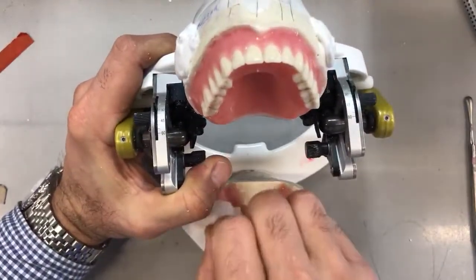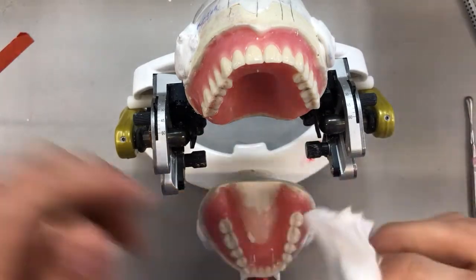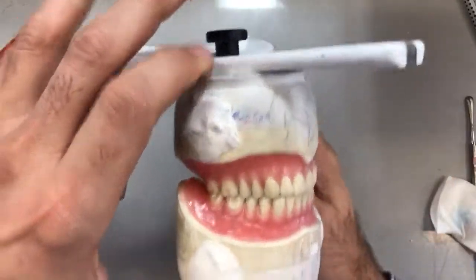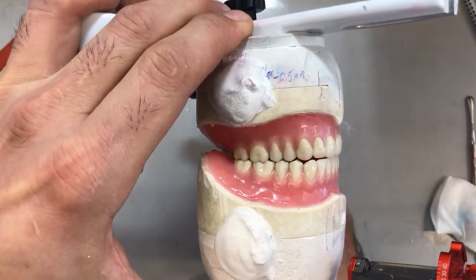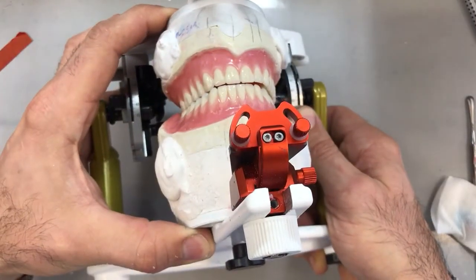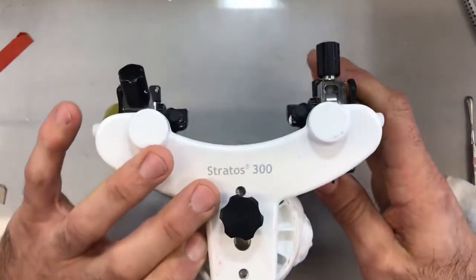If you reduce the cusp tips excessively on the uppers, it will affect the aesthetics of the plane of occlusion. I'm going to wipe everything down again, this time using alcohol from my alcohol torch — it's a little bit cleaner. Bringing the case back together, holding it, and shifting it over. Definitely now the shift is a whole lot smoother. The incisal edges are a little bit closer but not there yet, and the balancing side looks a little closer together, so I still have a ways to go.